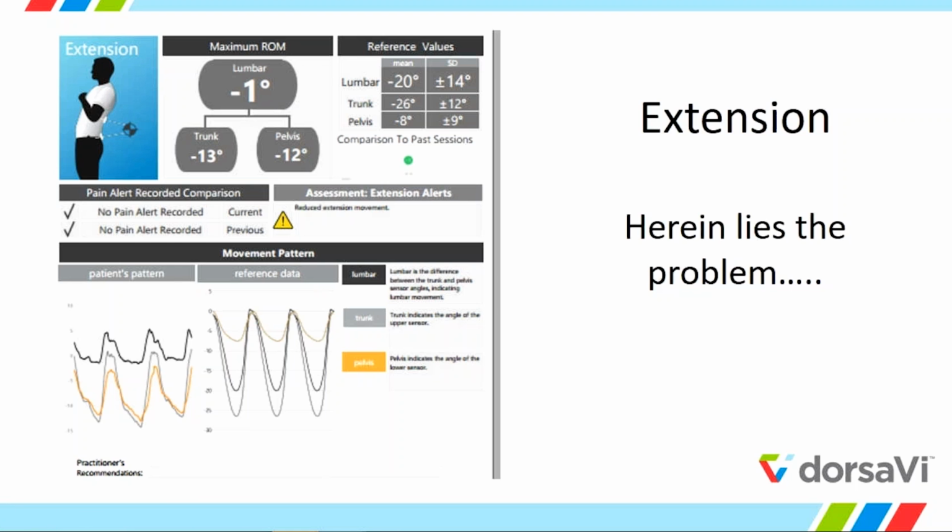His back and pelvis moved all at the same time. And then it's jagged. You can tell there are some neuromuscular control issues even if he's not having pain. That's an excellent example. We'll be curious to hear how he comes out. You can retest him and share it with us next time.